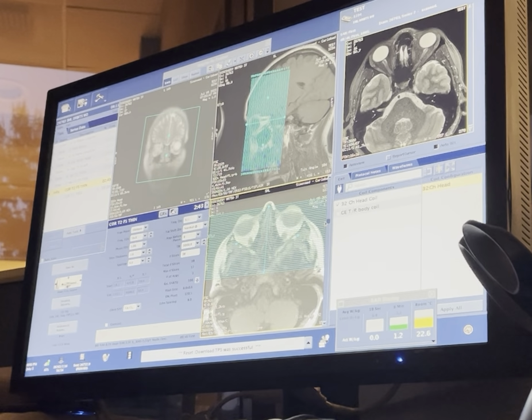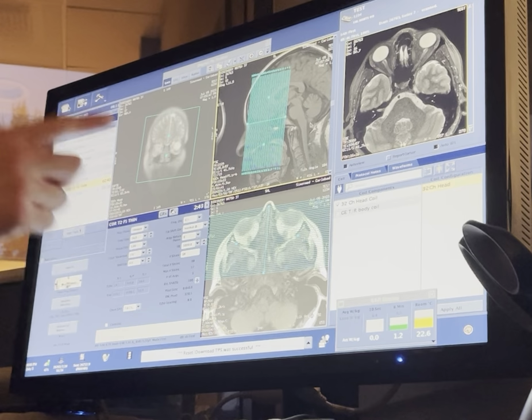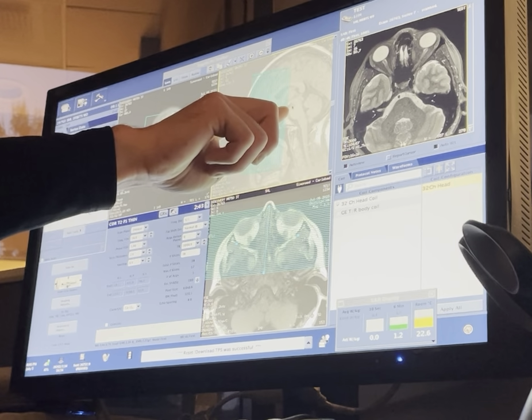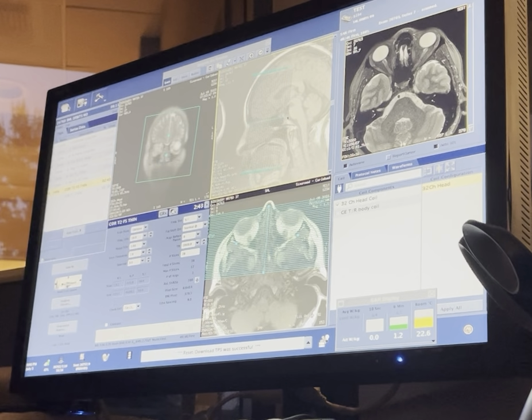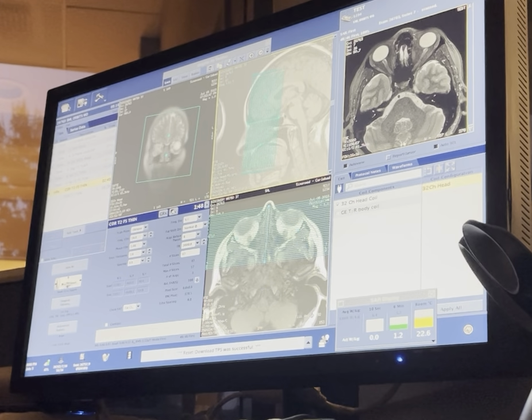Yeah, that looks good. Okay, so over here, let's go to midline, because this is the easiest way to see the optic chiasm. Midline is right there. Okay, so brighten it up. You see that line right there? That's the optic chiasm. We're barely covering it. I'm gonna have you go halfway through the brainstem. It's this bright line right there. It's really hard to see. This one? Yep, that one right there. Halfway through the brainstem, sometimes even past it, but that's good enough for me.